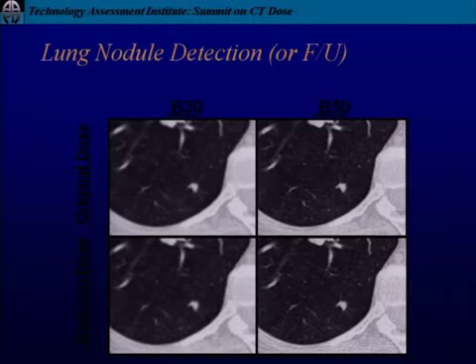So this is from our lung cancer screening trial, the National Lung Screening Trial. We did this at what we called our conventional technique, which was down around 25 effective mAs. This is the original, about 25 effective mAs, and I think these were 2.5 millimeter thick slices. And here we simulated a lower dose acquisition, and we did this with two different reconstruction kernels, okay? A B30 and a B50.